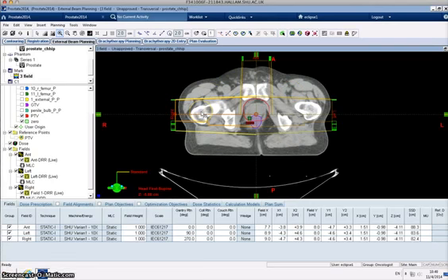You're obviously going to create a 4th field, and so you need to have a think about how you're going to do that, which shouldn't be too difficult.